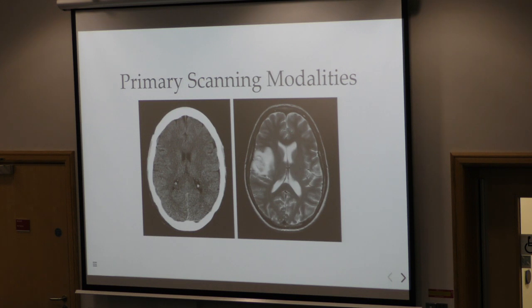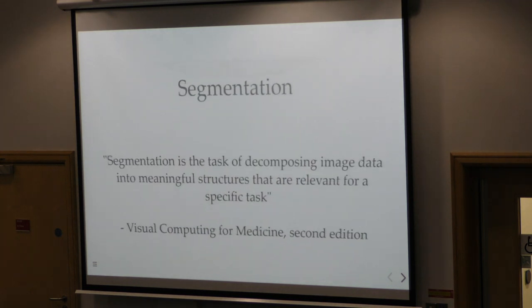But aside from visualization, it's not that flexible an approach, like using a geometric mesh, where the models are actually represented as points in space building up faces that make a polygonal shape. That's a lot more flexible to operate on in a virtual space and to use as the basis for a 3D print. So in order to do that, we need to first go through this segmentation process.